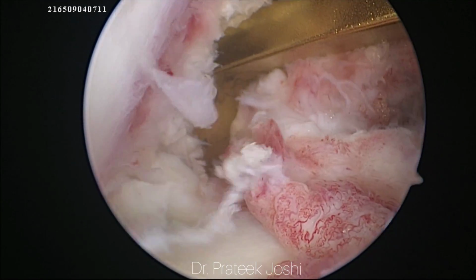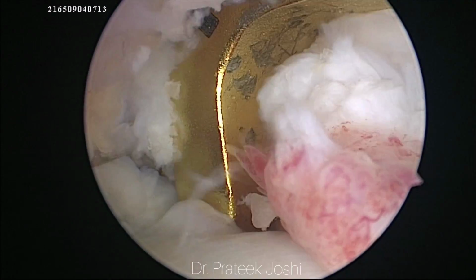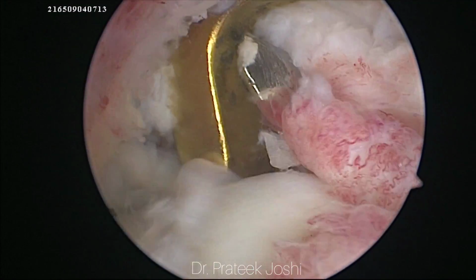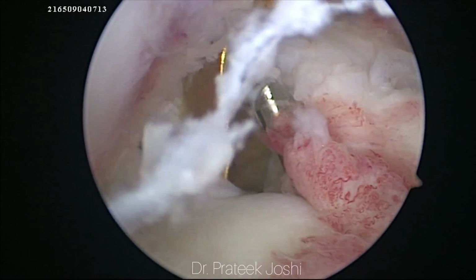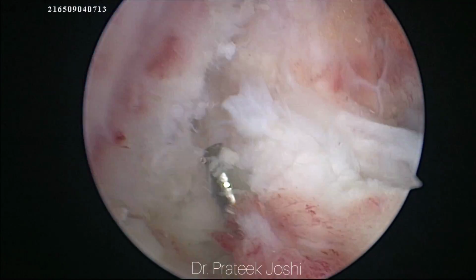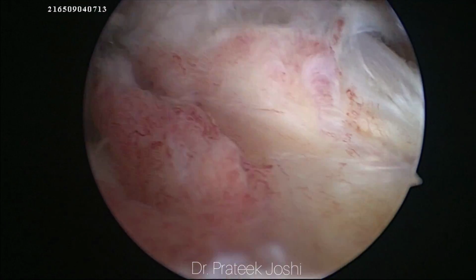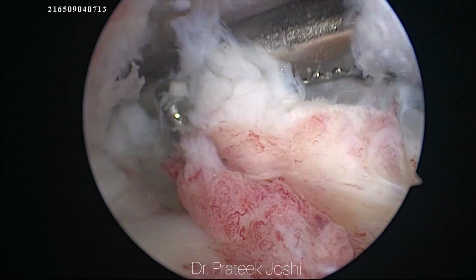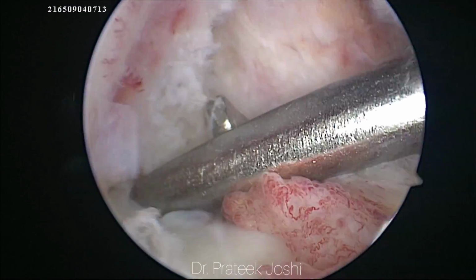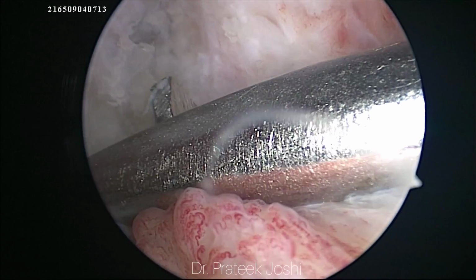Our graft diameter is 9 mm, so we are going to make our tibial tunnel slightly posterior so that we don't have graft impingement, which might be a problem when we are using a 9 mm graft. The ideal footprint is just posterior and medial to the anterior horn of the lateral meniscus. As you can see, the tip of our guide wire is in anatomical position, and now I am going to drill over this guide wire in a sequential manner, starting with a 6 mm drill and then going to a 9 mm drill. We had adjusted the angle in our ACL tibial jig at 55 degrees, and we had kept our ACL jig at around 20 degrees medially.